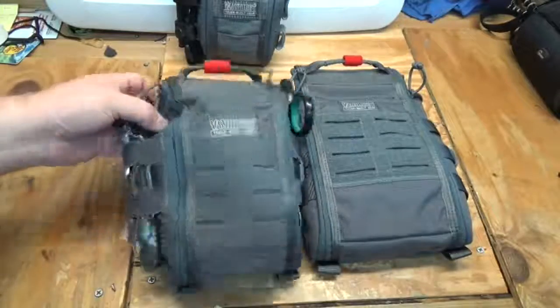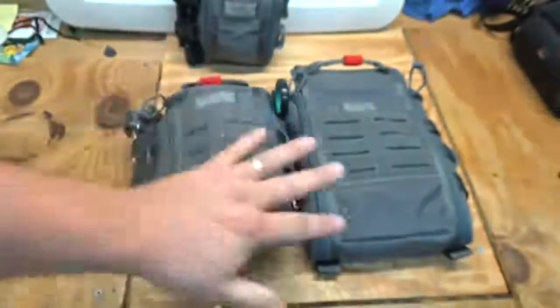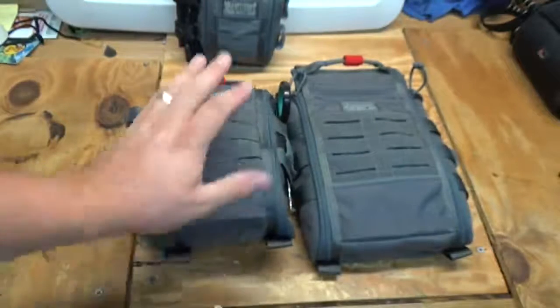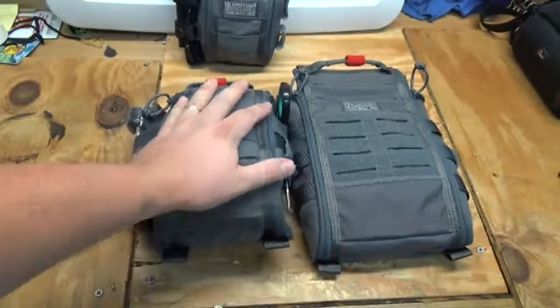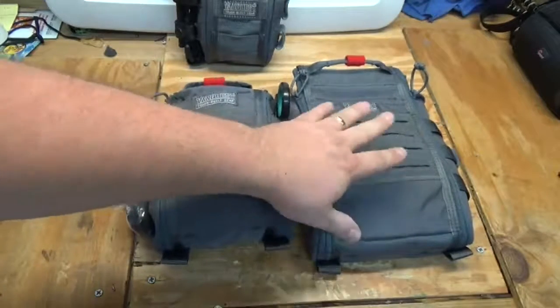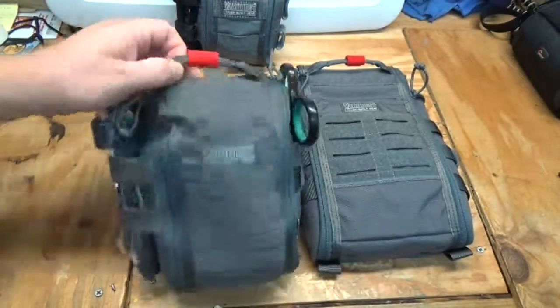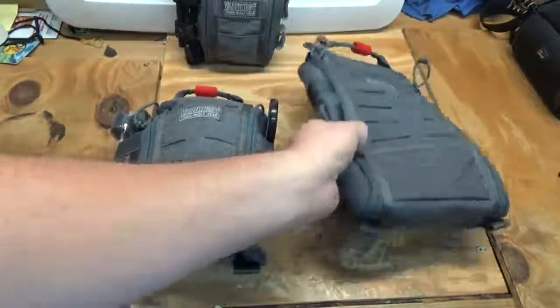I've already got the 5x8 set up as a first aid or trauma kit. These would make great car kits or group kits. This one here is going to be a car kit — I'm going to put this in the car — and I'll load out the 7x10 and show you that in another video. Anyway, let's go over the new changes they've made in the Gen 2.